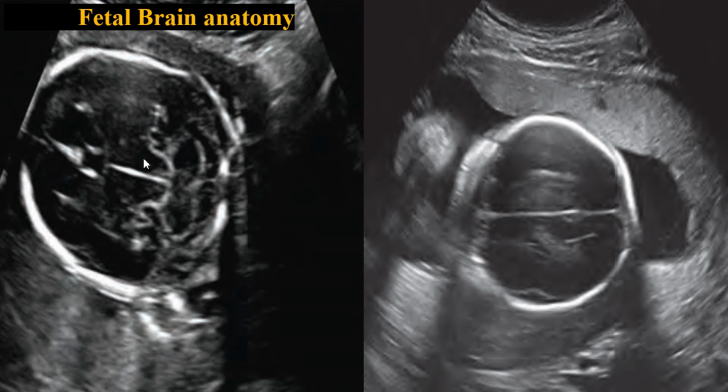Here we can see the axial image of the head of a fetus, and this sonogram depicts the thalami. A pair of thalami is seen here, and here we can see the rectangular shaped structure, which is the cavum septum pellucidum, and it is always an anechoic structure anterior to the thalami.